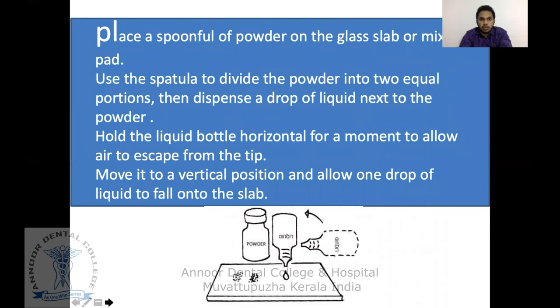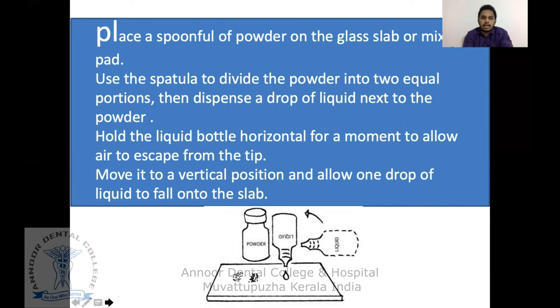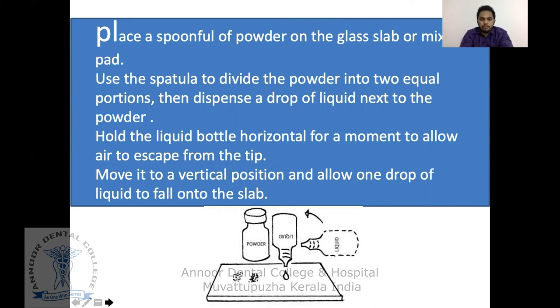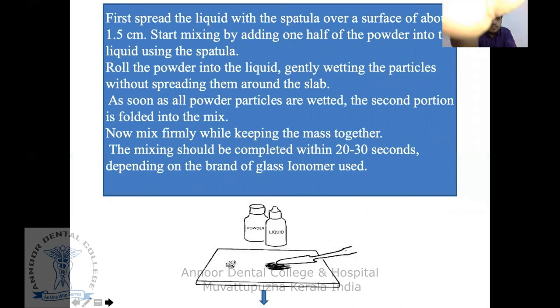As a general rule, place a small spoonful of powder on the glass slab. Use the spatula to divide the powder into two equal portions, then dispense a drop of liquid next to the powder. Hold the liquid bottle horizontal to allow air to escape, then move to a vertical position and allow one drop of liquid to fall onto the slab. Spread the liquid with the spatula over a surface of about 1.5 centimeters.